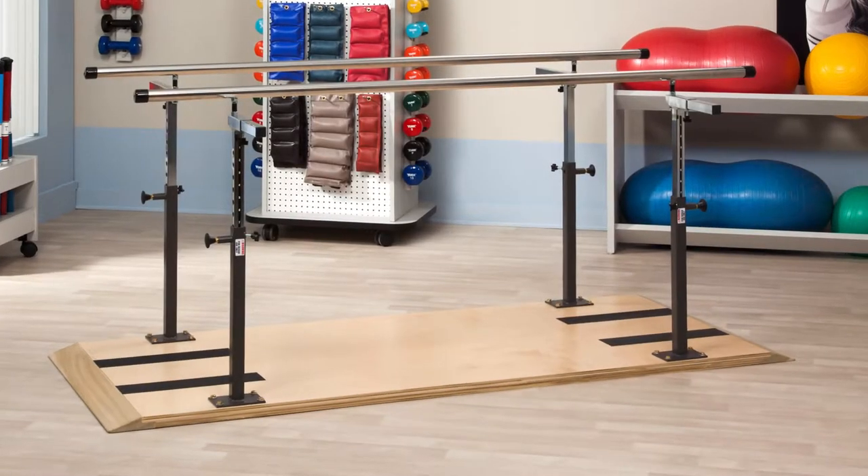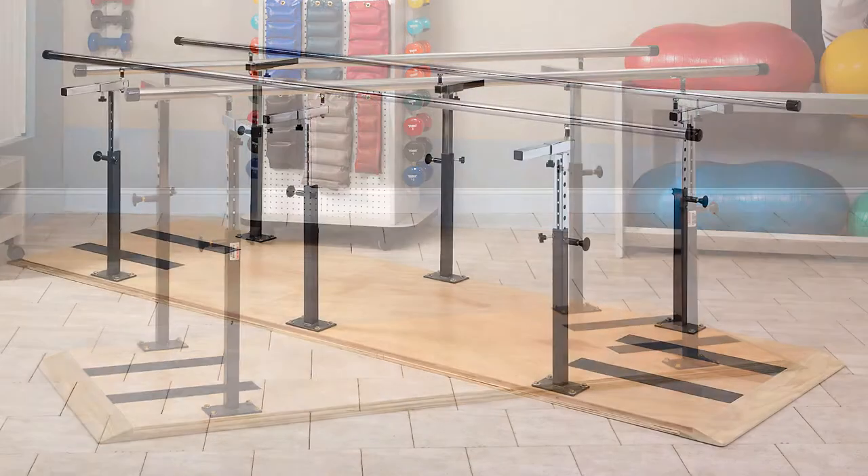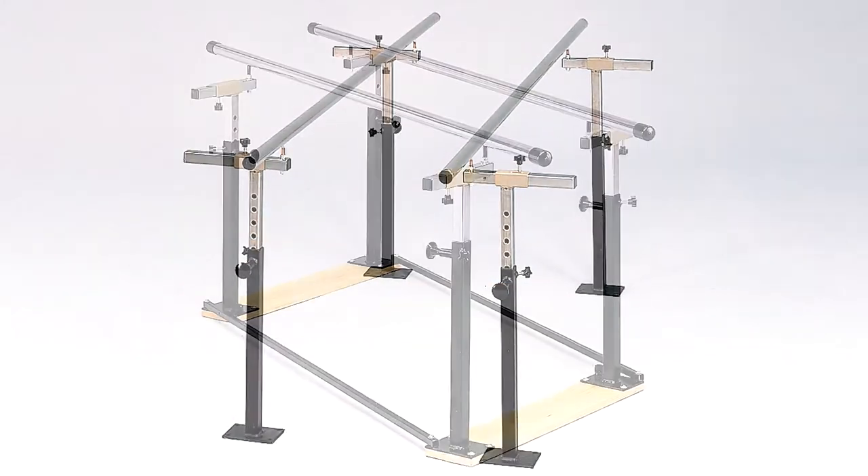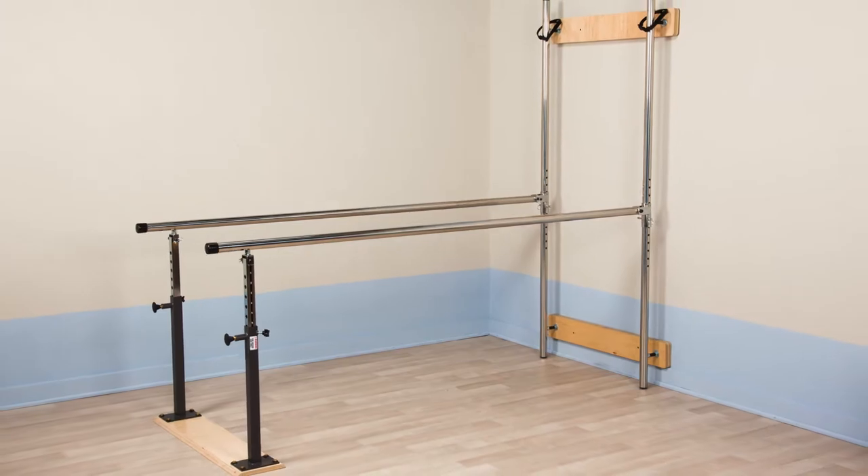Clinton has six models of parallel bars, from standard platform and bariatric transfer platform models to floor mounted, floor folding, and wall mounted folding parallel bars.